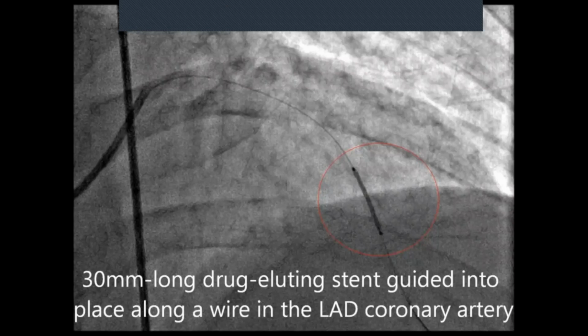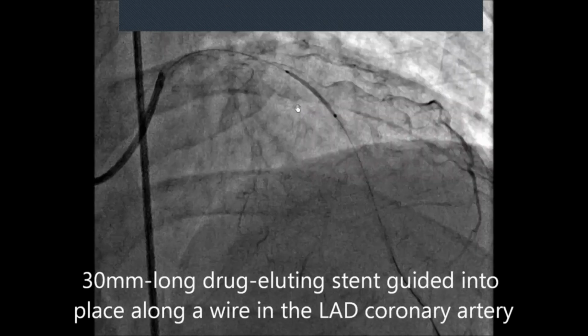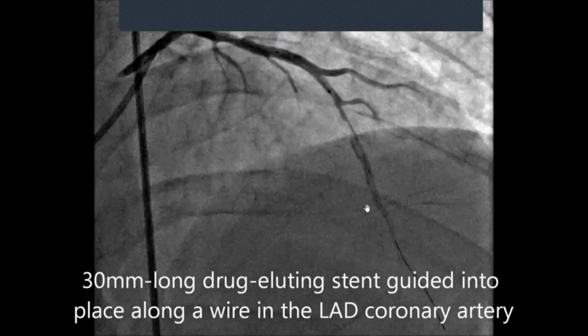There's the stent being moved along into the area where the blockage is. So it's exactly what they showed us in the last one. This is just showing it under fluoroscopy, just so that you can see. You can see it's quite an intricate and delicate procedure.